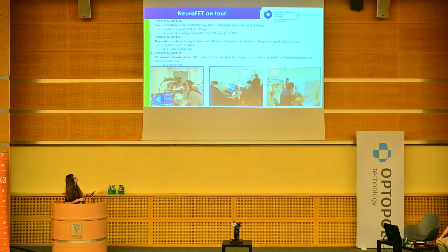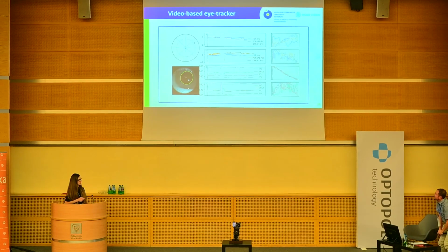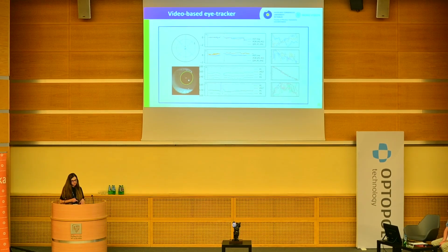To conclude, our device is fully clinical. We performed 3 clinical trials, and 1 is in progress. Only 1 minute. We know that the retinal tracker has some limitations, so we should remember that we also have this anterior pupil camera.